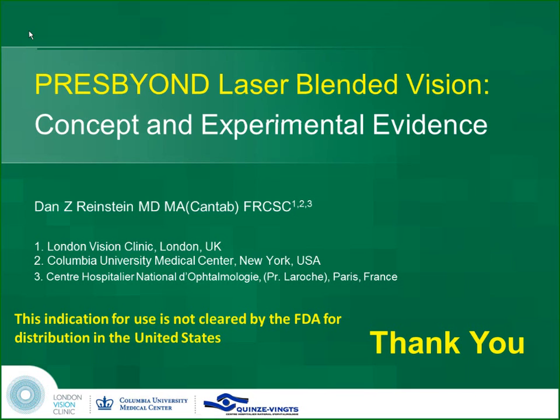If you look at my spherical aberration increase that I demonstrated yesterday for the Summit 5 millimeter -6, the patient, his spherical aberration was pouring out of his ears just for a -6 correction. That is history, and you need to lock your minds into thinking about corneal surgery in a different way. Nidek, Schwind, and the MEL 80 are doing extraordinary jobs of controlling spherical aberration now. And it is a different paradigm. We are not just thinking about what we used to do.